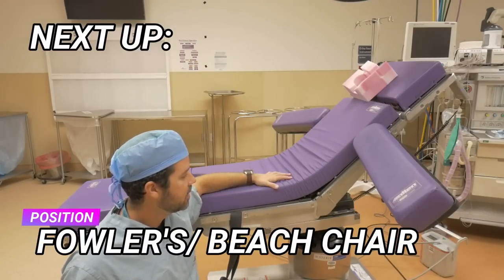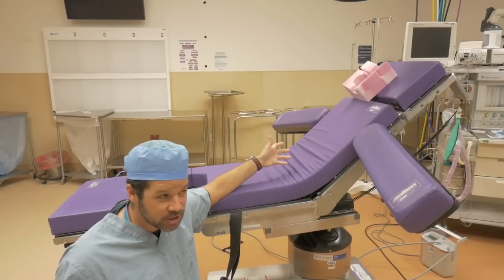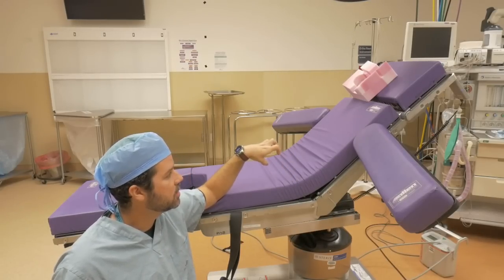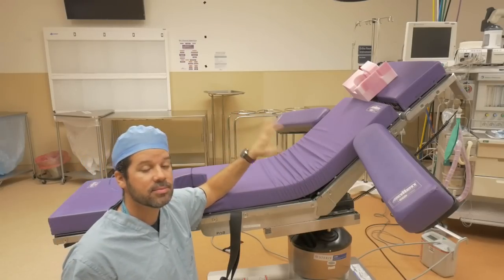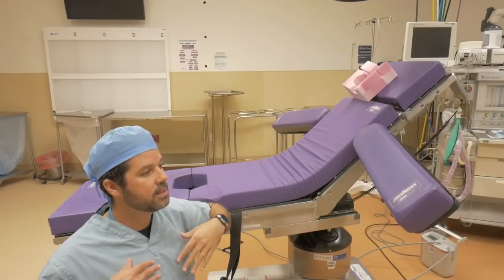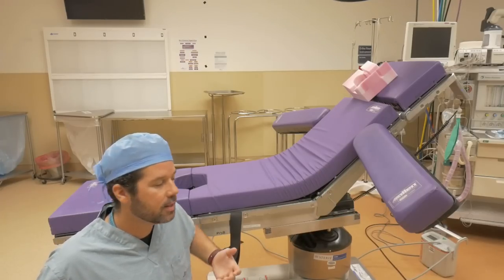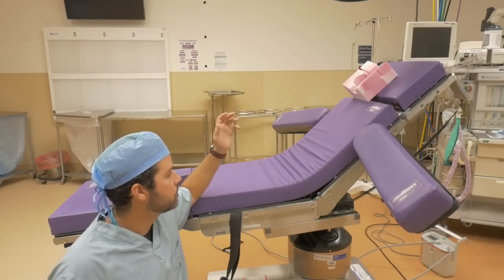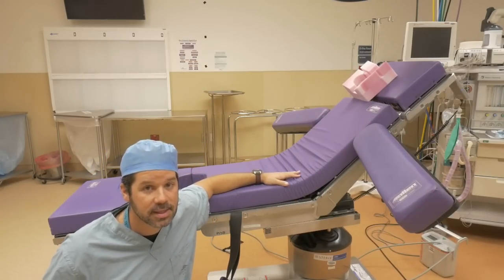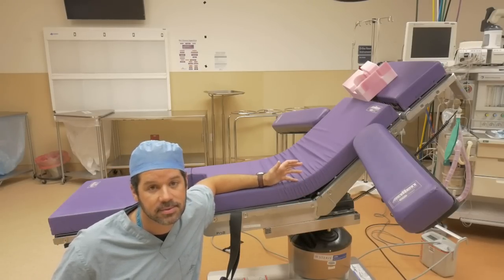This next position is Fowler's position, sometimes called the beach chair position. A lot of cases you'll see in this position include breast surgery — where you need to see the natural lie of the breast — shoulder arthroscopies, and possibly certain types of head cases as well.